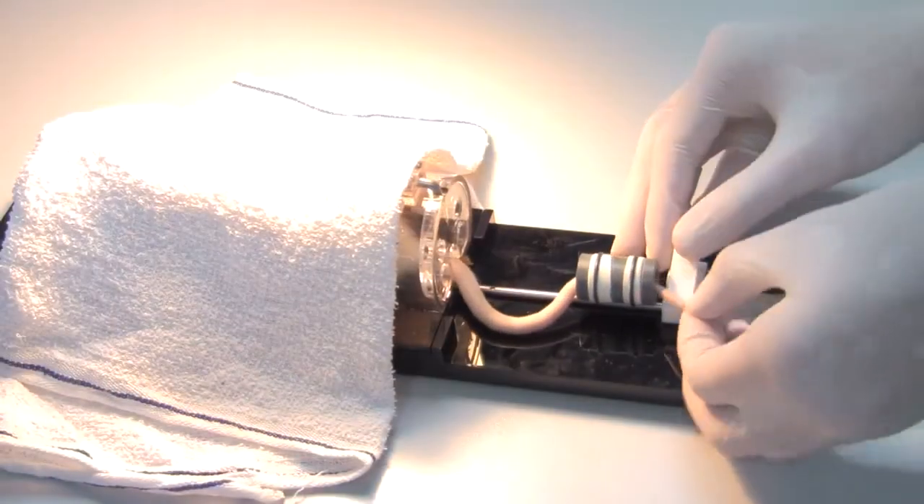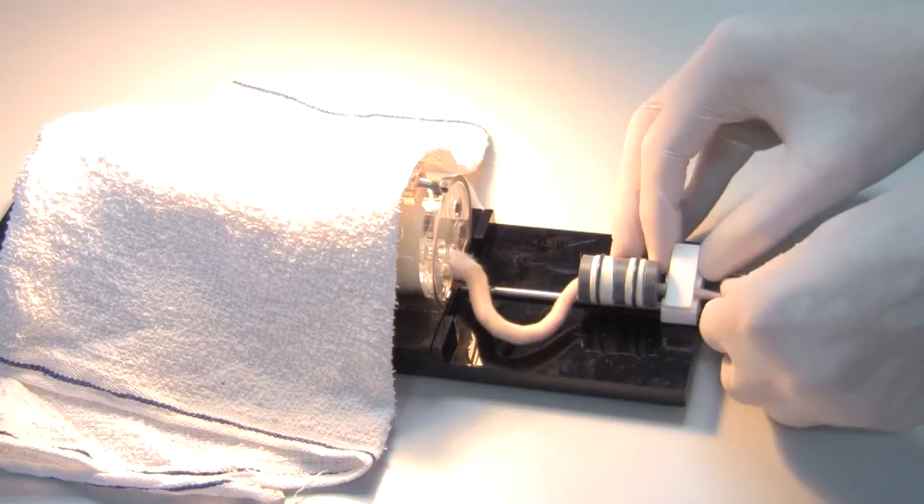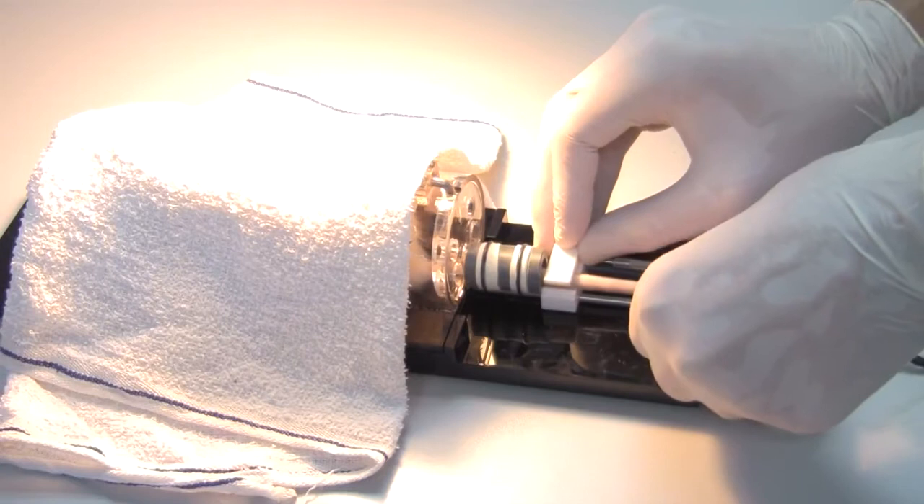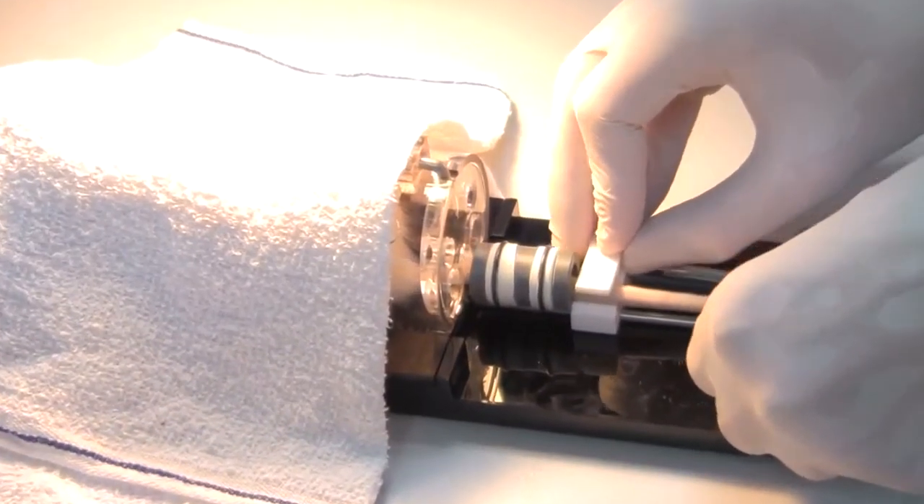The tail cuff is slid over the subject's tail along the tail cuff holder until it rests closely to the tail end of the restrainer. The tail is also placed securely within the pulse transducer.